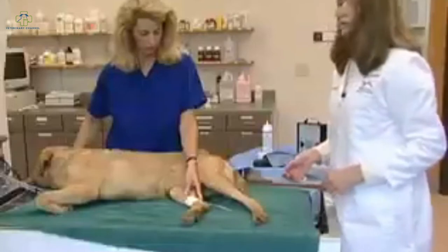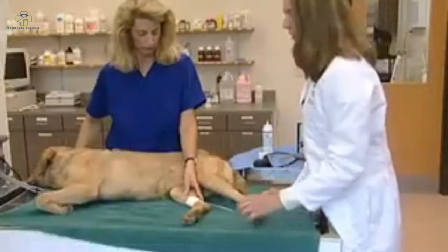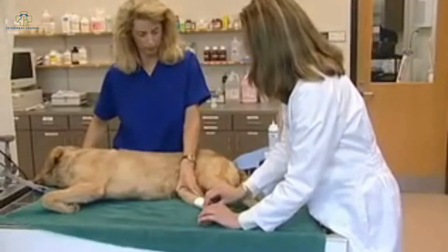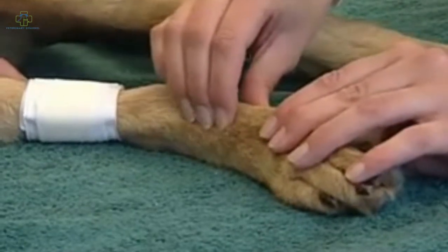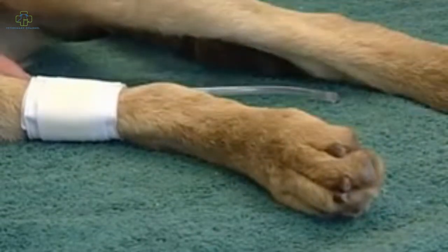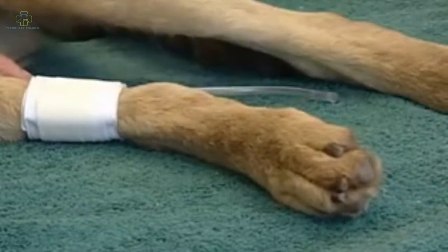Once the cuff is securely in place, we're going to go ahead and locate the pulse. Once we've located the pulse, we're going to go ahead and shave a small area of fur above that location.